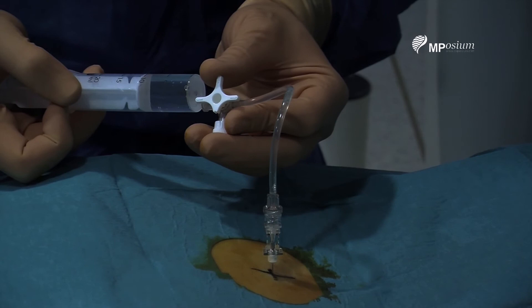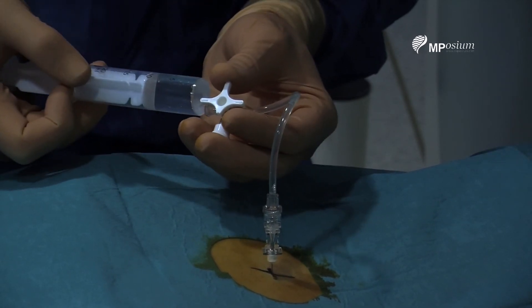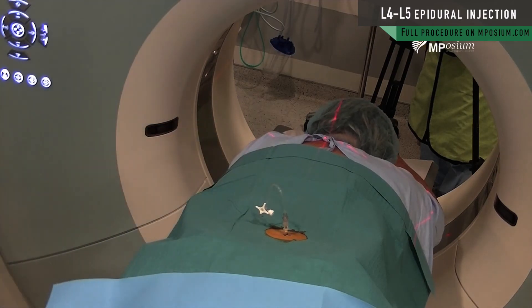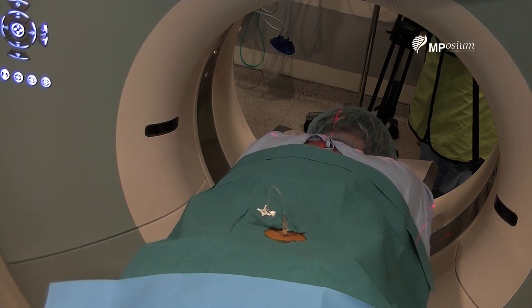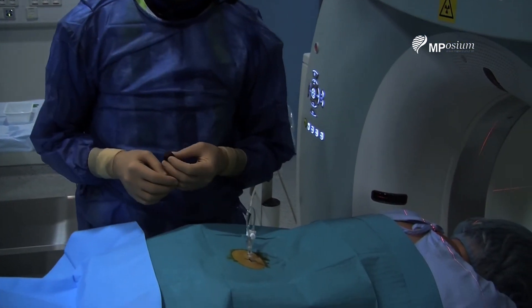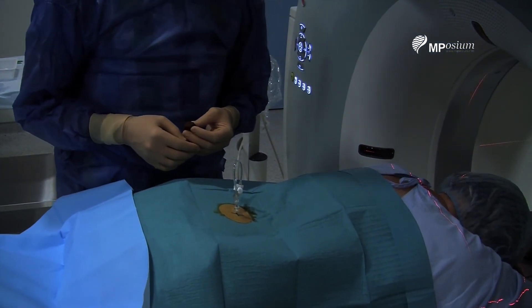I can put one cc of local anesthesia, not more, because you will have patchy anesthesia if you put too much, and the patient will not be happy if she cannot move her legs after the infiltration. So now I'm ready to pull out the needle — the infiltration is over.